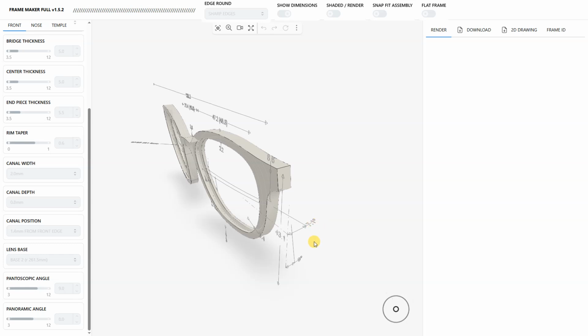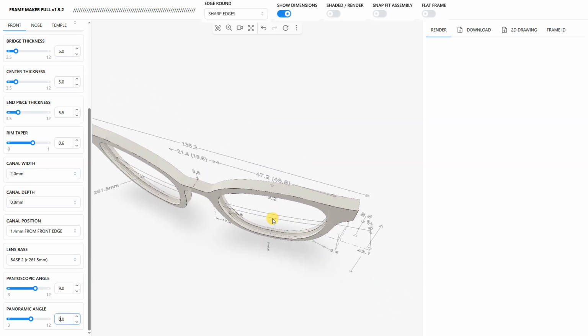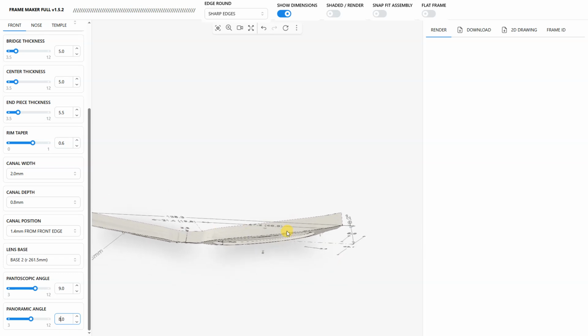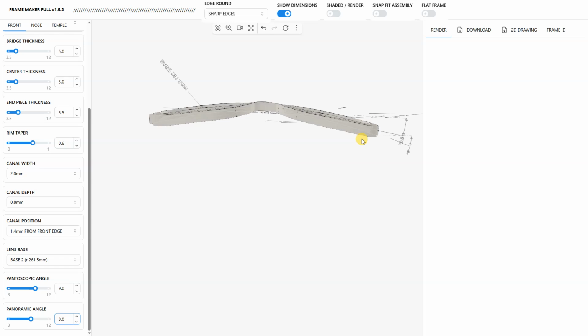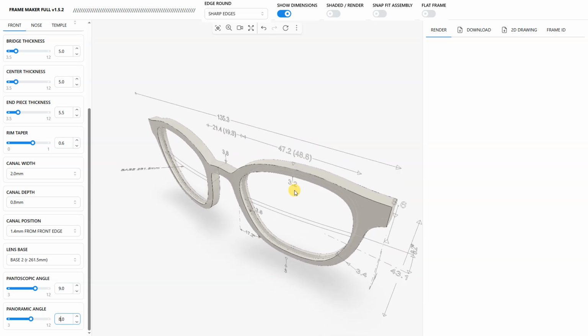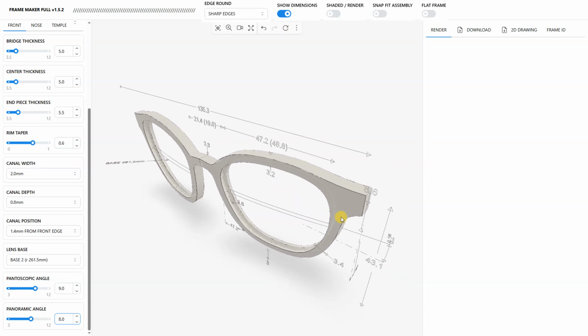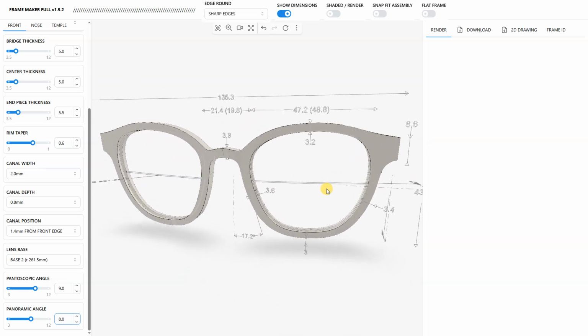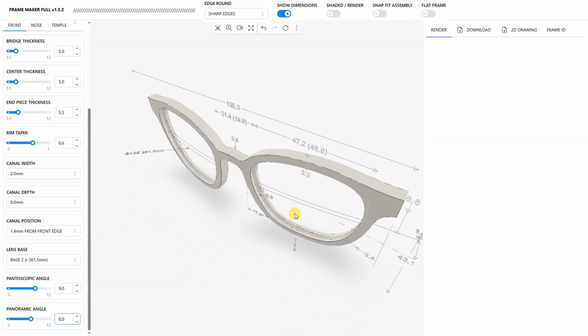So it's 7.1. You can see it's picking up a decimal there, but that's not important. 8.2, and it's tilting from the lens center. So that's how I tilt my frame to arrive at the overall front curvature. All of this is quite tricky. I've known from working from shops that all of this is pretty different. It's done somewhat differently in each shop. Everyone that I talk to has a slightly different version of this. So if you have some recommendations or suggestions for ways that this should be implemented differently, just let me know. I'd love to hear it and see if I can consider implementing some of those changes.